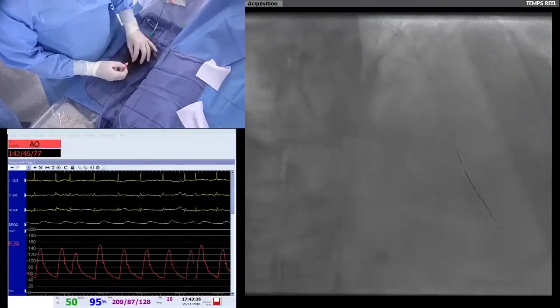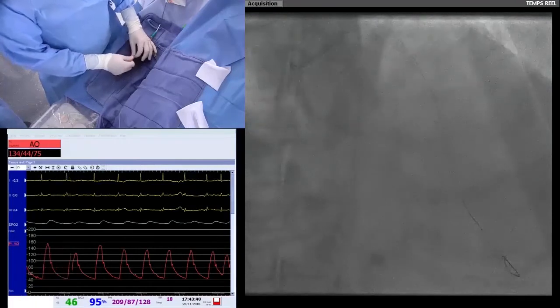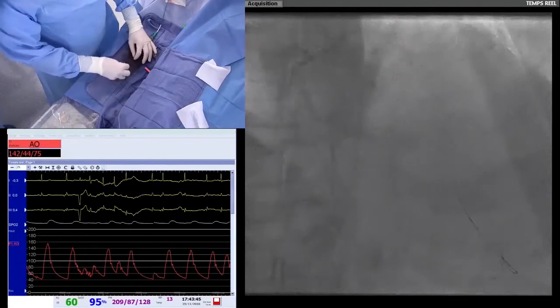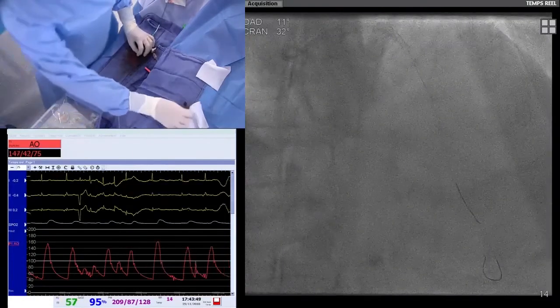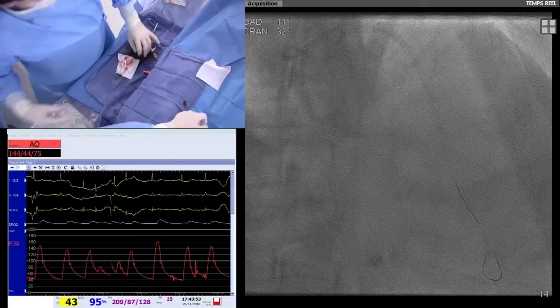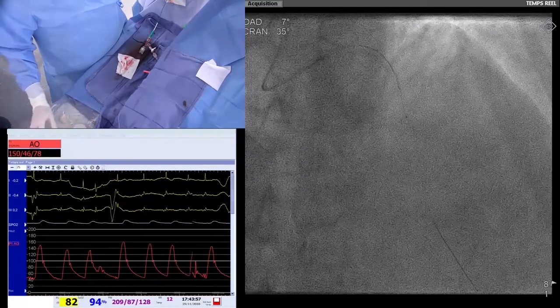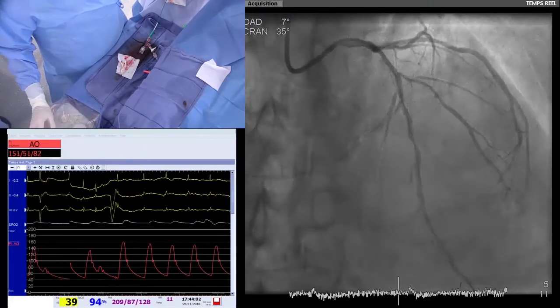Yeah, well, actually, as you heard from the beginning, from the IVUS pullback, we have a landing zone of the LAD that is around 3 millimeters, 2.75, 3 millimeters. I think from now on, we have to complete our plaque modification that has been just started by rotablation. I would personally prefer to use now a 2.75 or even a 3 millimeter non-compliant balloon, to do further plaque modification on the LAD.